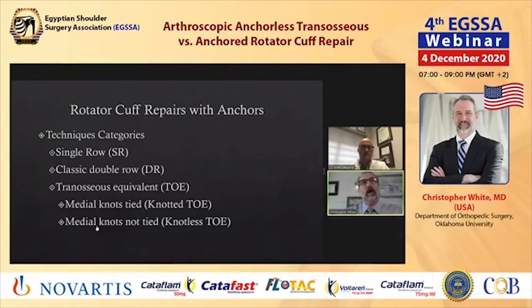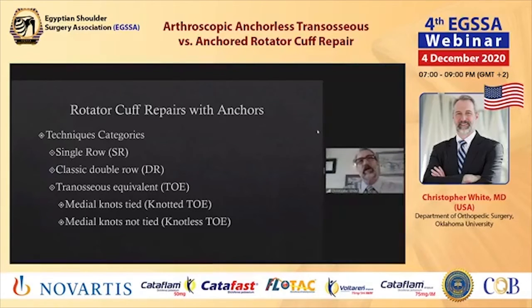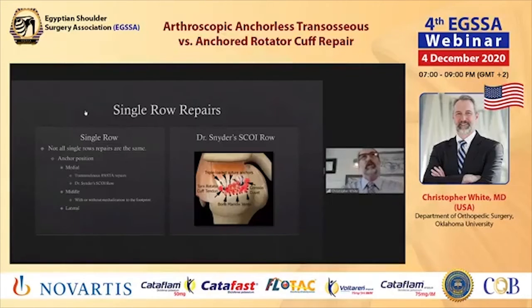And ultimately, we've developed transosseous equivalent, which are linked double row constructs, which link the medial sutures to the lateral rows mechanically. And we can subdivide this category into basically knotted transosseous equivalent techniques, where the medial knots are tied, and then knotless techniques, where the medial rows are not tied and are affixed definitively to the lateral row anchors. So just a word about this.